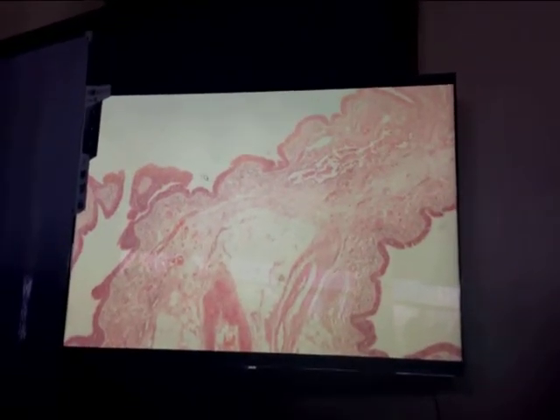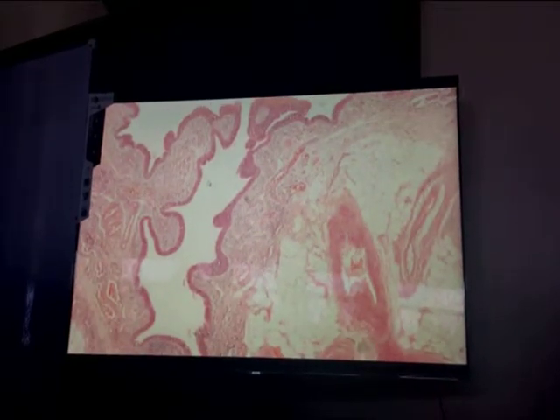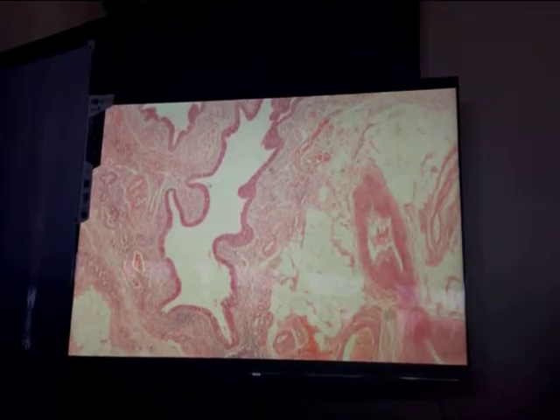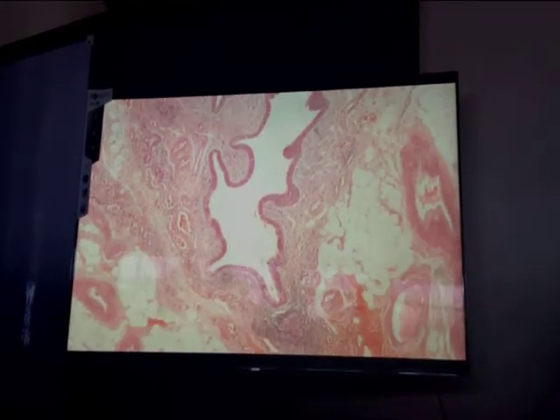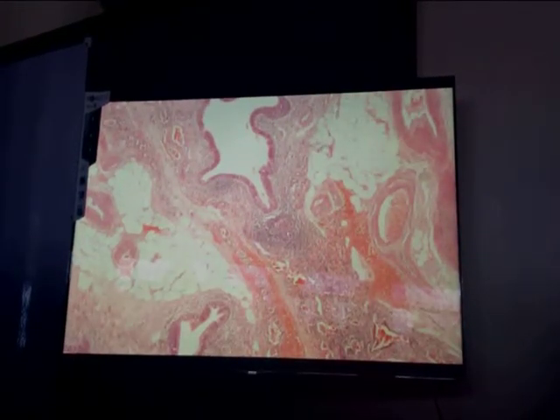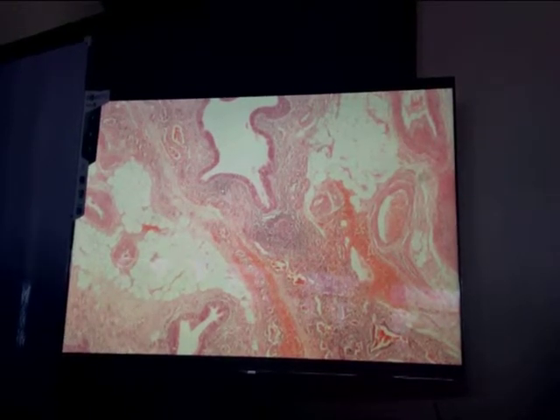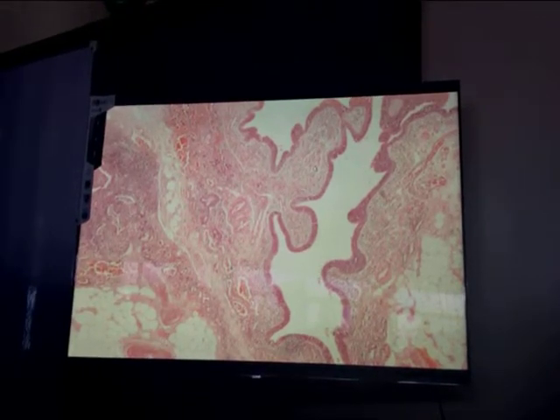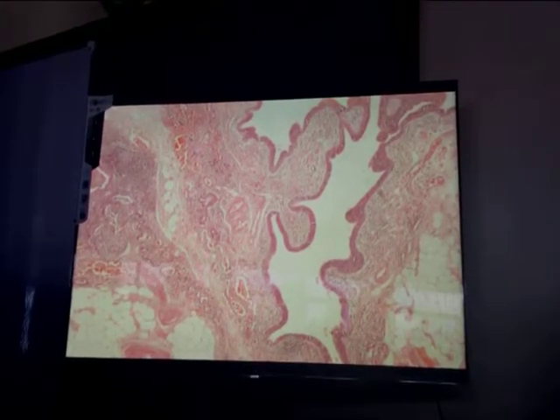None. So technically, the airway shown should be classified as bronchiole. However, look at the size of the bronchioles. Is that the regular size of a bronchiole? They have become markedly dilated already. And then as you can notice, the wall is dirty because it is infiltrated by not neutrophils but mostly lymphocytes and macrophages. Note the lymphoid follicle formation. And then the wall also exhibits fibrosis. So those are the features of bronchiectasis.